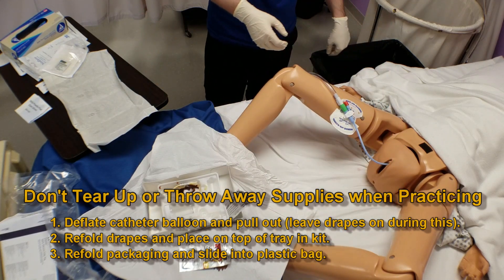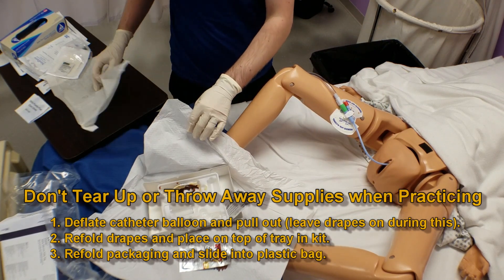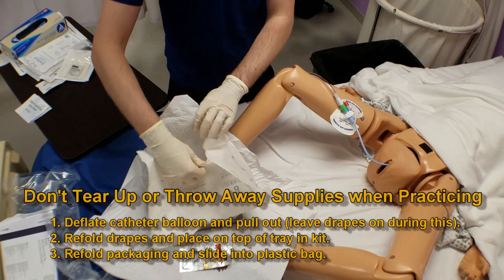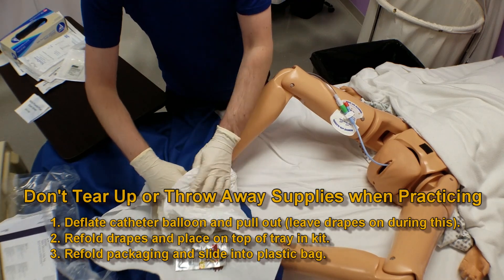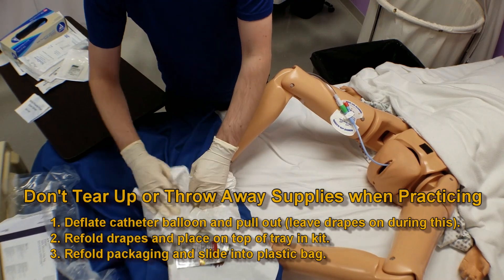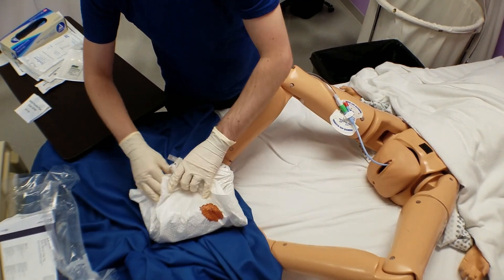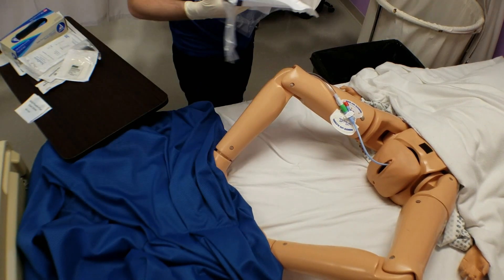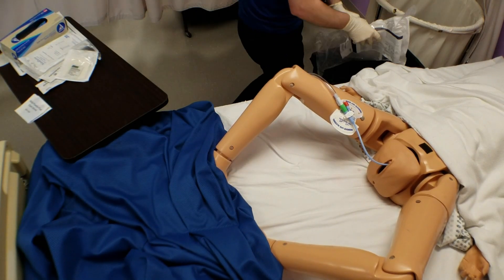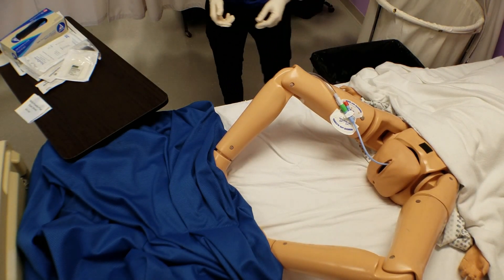At this point, you may clean the perineal area as needed. Then dispose of your supplies, remove your gloves, wash your hands, and help the patient to a comfortable position that provides privacy and warmth. Remember not to throw away supplies when practicing — remove the catheter first to remove your drape without ripping it. Verbalize that you would check your collection bag to ensure that the urine is flowing. Your evaluator will then help you reset the mannequin for a male straight catheter insertion with urine specimen collection.